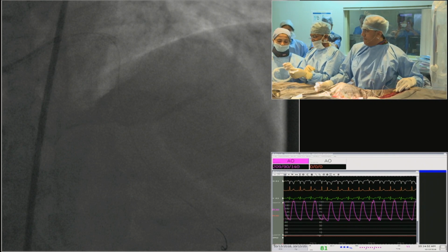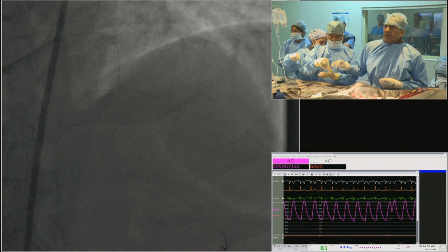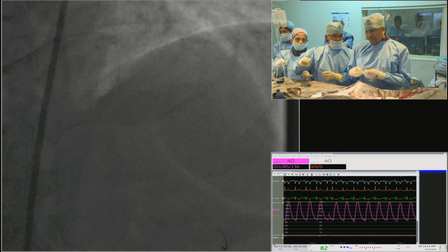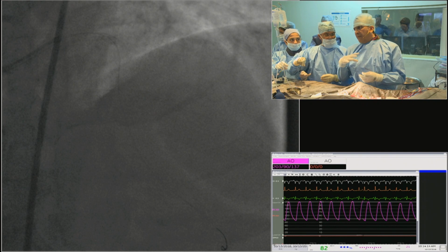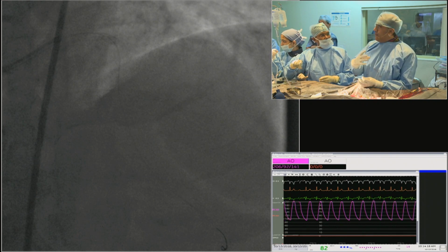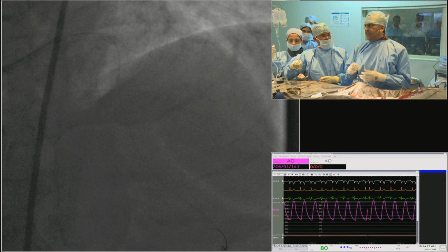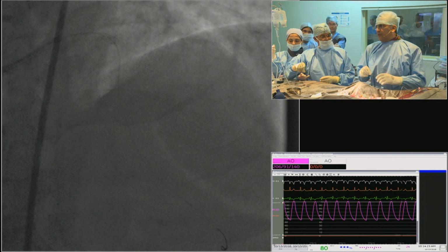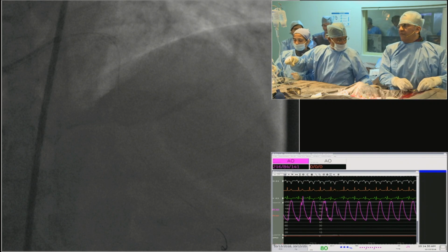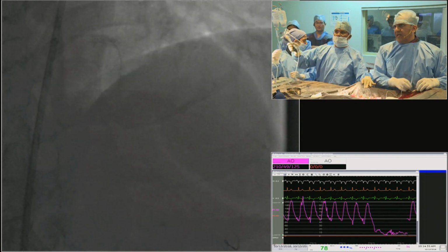Well, we have just seen a snap. They know what the real size is. I still feel it is about 3. The nice thing is that you can take a 2.5 stent and expand it, make it 3, 3.2, 3.3. But my whole take on these atherosclerotic lesions is that proximally you can be a little aggressive, but distally try to be gentle. You don't want a dissection spiraling down. You don't want to be subintimal at the edge of the stent. And with imaging there, you can always optimize it as we go along with a bigger balloon.